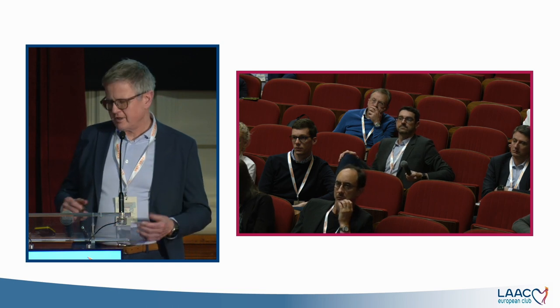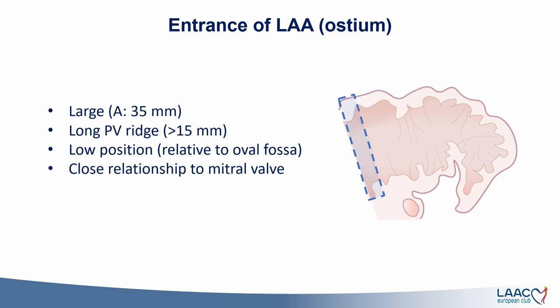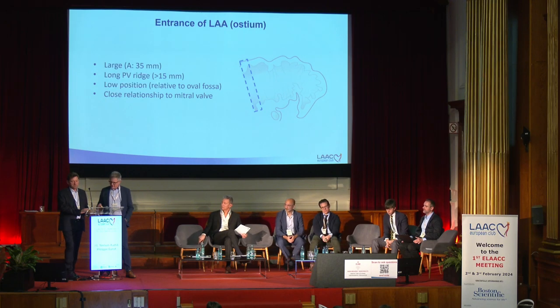Yeah, no, the numbers that you see on this slide are not meant as a very specific definition. Because what you are saying is that in many cases you will not be able to give a precise measurement, and it will be very difficult to define in every case. So this is more of a practical concept, that you as an implanter consider this to be a very large ostium, or you think you have struggled in this case, or when you see it on CT with a long PV ridge. We have discussed whether we could give very sharp definitions of things. I think that would be very difficult. But we can come back to the discussion.